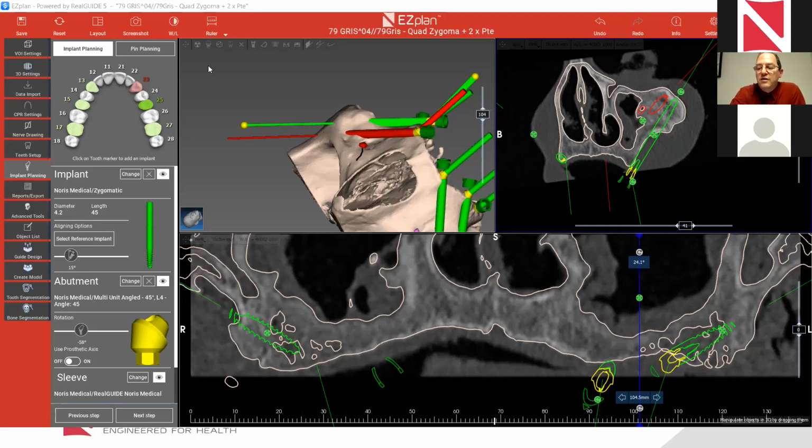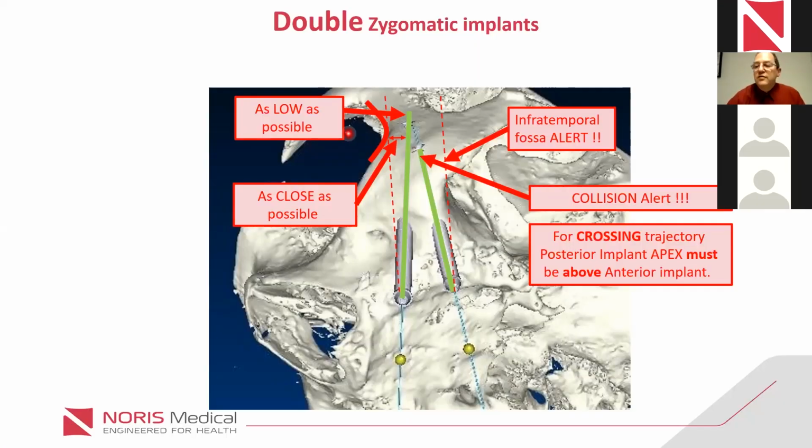You hear me? Yes, I can hear you. So just an assumption, Rami, in case I do make this implantation into this area, and I find out that the implant that I have ordered and that was delivered is too long, is it possible just to cut the screw? No. No, it's not possible.